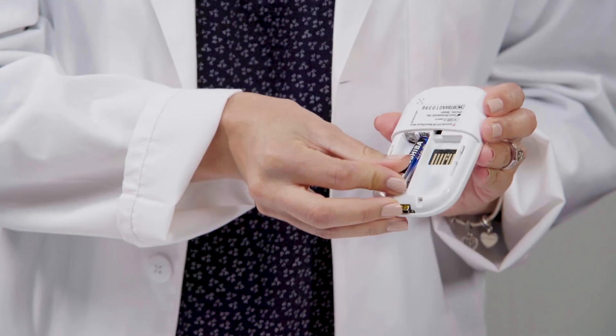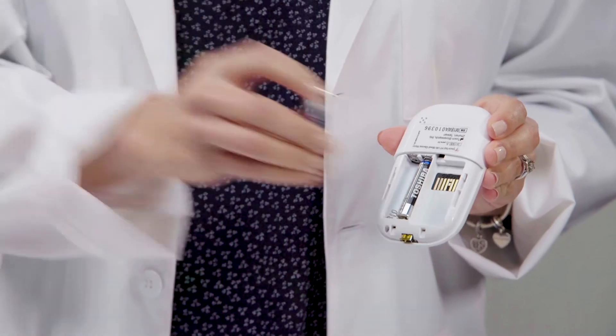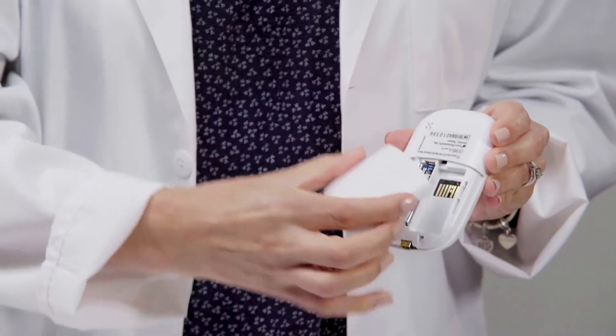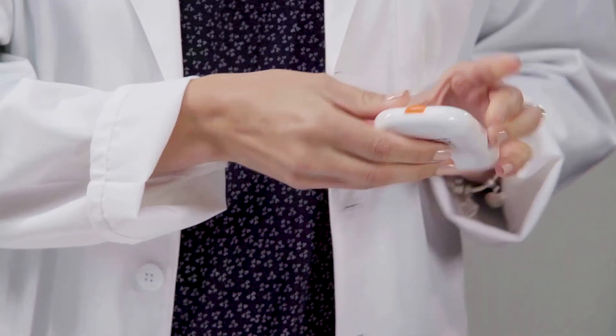To set up your blood glucose meter, first install the batteries that are included. You can start testing without setting up your device. However, we recommend that you handle setup first. It takes just a few minutes.